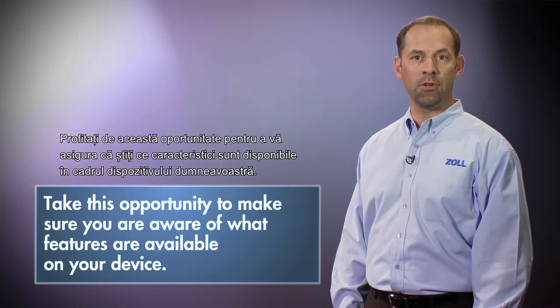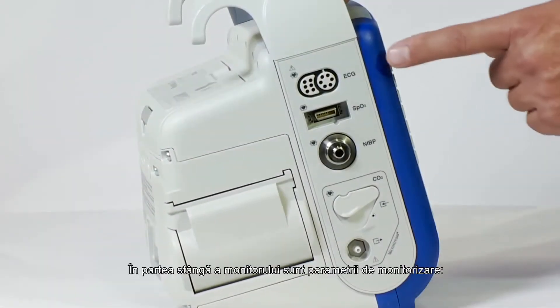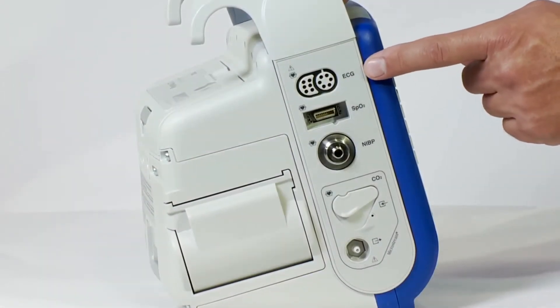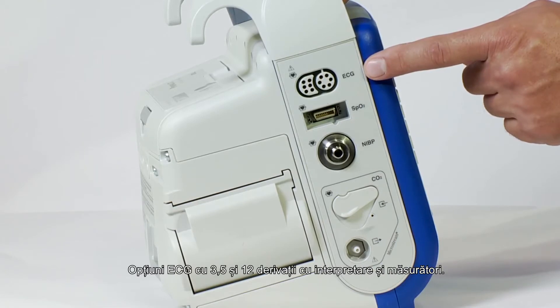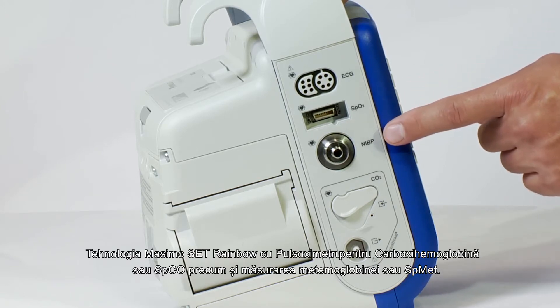Take this opportunity to make sure you are aware of what features are available on your device. On the left side are the monitoring parameters: 3, 5, and 12 lead ECG options with interpretation and measurements. MASIMO SET Rainbow Technology with pulse oximeter based carboxyhemoglobin or SpCO, as well as methemoglobin or SpMET measurement.